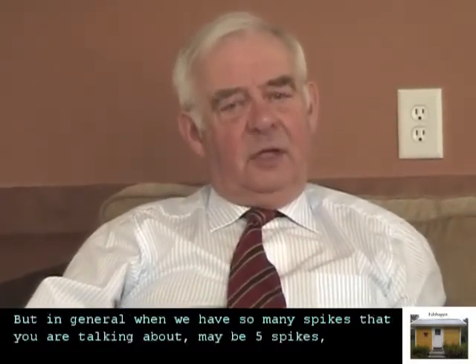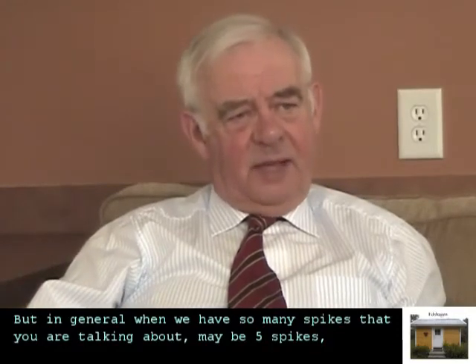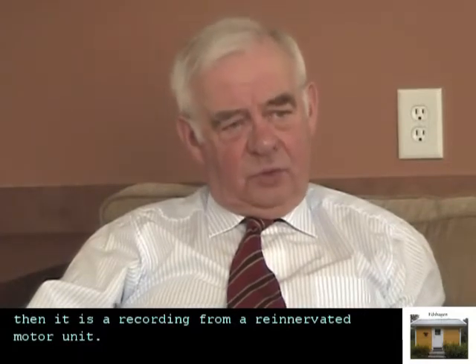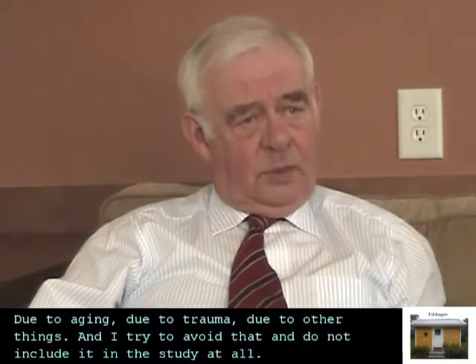But in general, when we have so many spikes, maybe 5 spikes, then there is a large risk that we're recording from a reinnervated motor unit, due to aging, due to trauma, due to other things. And I try to avoid that and do not include it in the study at all.